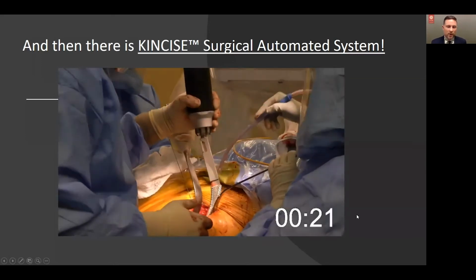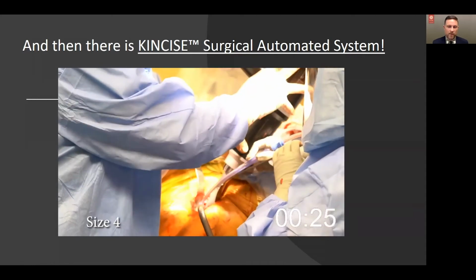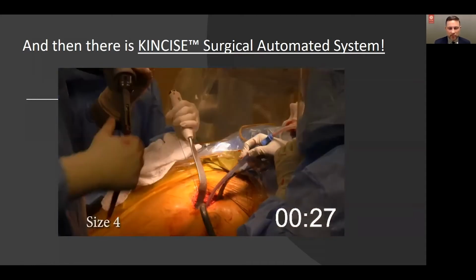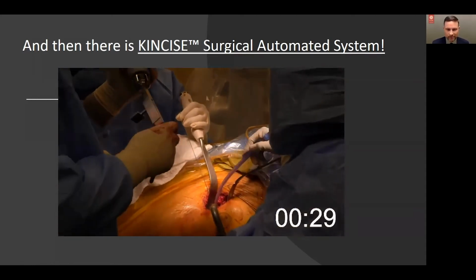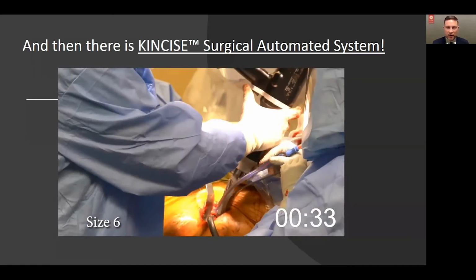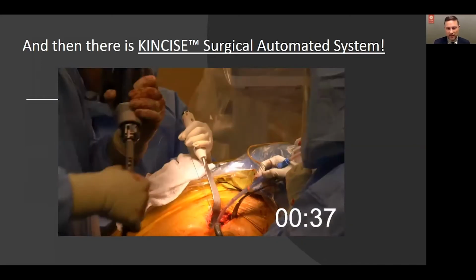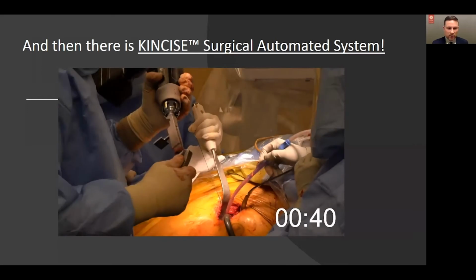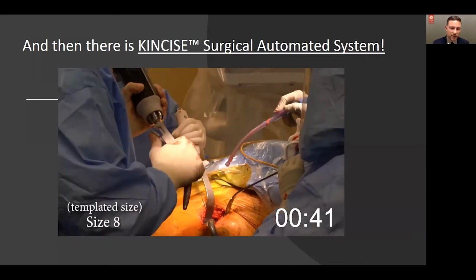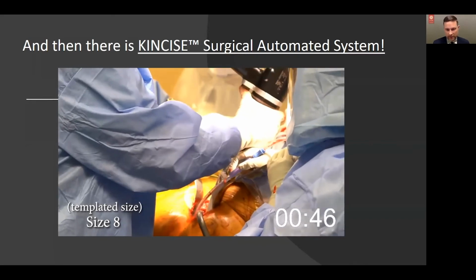The important thing I want you to see when I'm doing this is basically I'm broaching the femur with my thumb. So I'm not using my shoulders. I'm not using a mallet. I'm simply pulling the trigger with my thumb, and I'm broaching the femur. And I use this for everyone. I use it for little old ladies. I use it for osteoporotic fractures. I think it's the most reproducible and consistent thing I use, and I just love it.